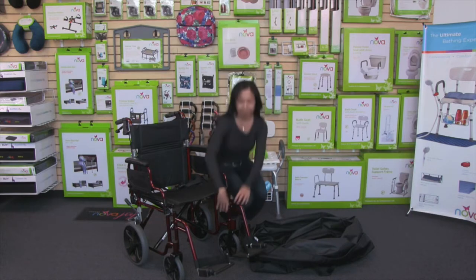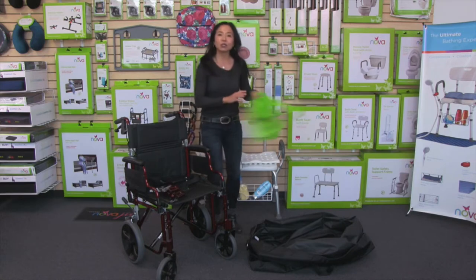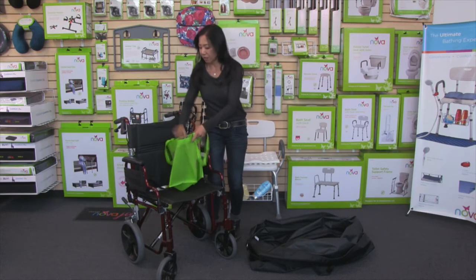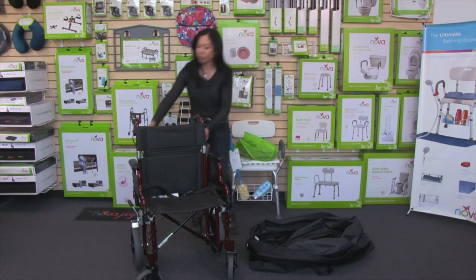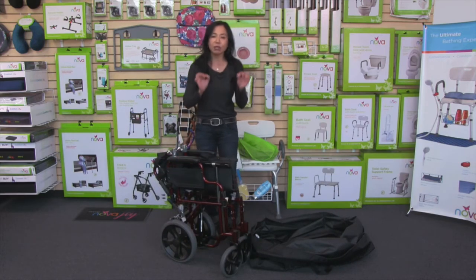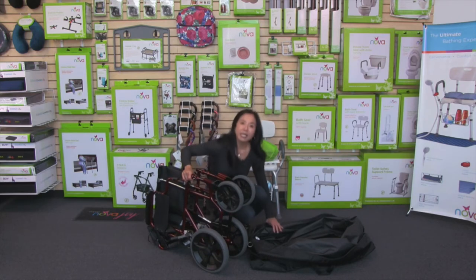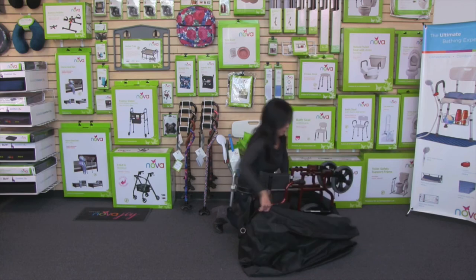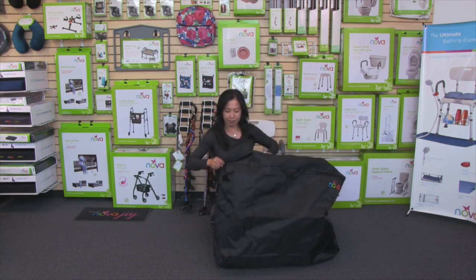First, you're going to want to remove the footrests. It's a good idea to protect them — use a reusable grocery bag, one that is fabric and strong, and just put your footrests in there and tie it up so it stays secure. Then fold the transport chair. The key to getting it into the bag is making sure it's in the right direction — flip it on its side with the front wheels facing upward. Have the bag opened up so it's easier to insert, then put the footrests inside and zip it up.